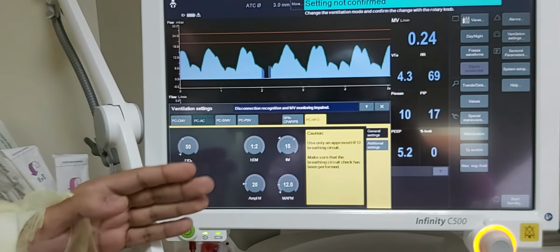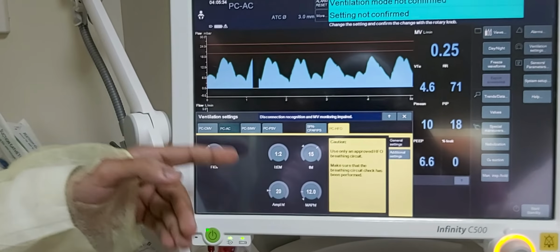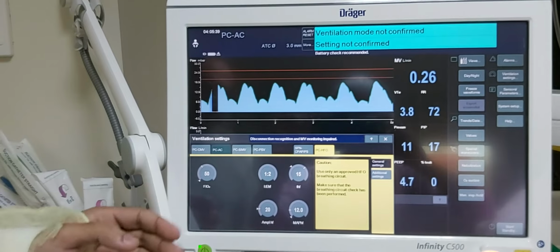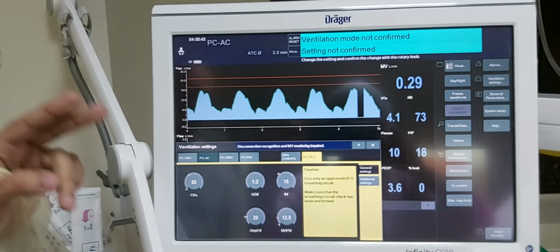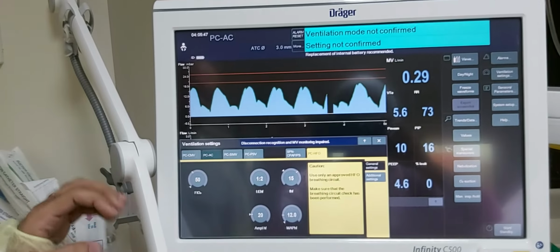After that it will show 5 parameters. One is fixed, which is the I:E ratio 1 to 2 for all patients. Of the other four parameters, 2 are for ventilation and 2 are for oxygenation.